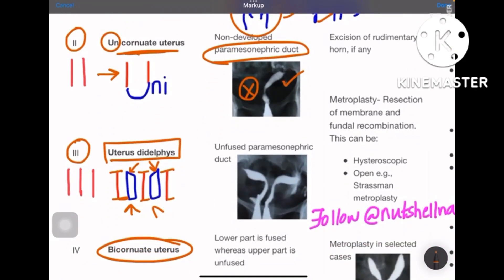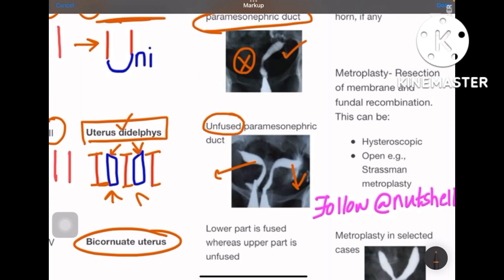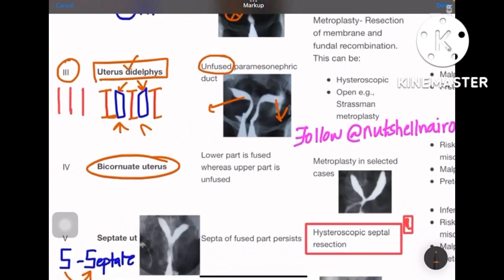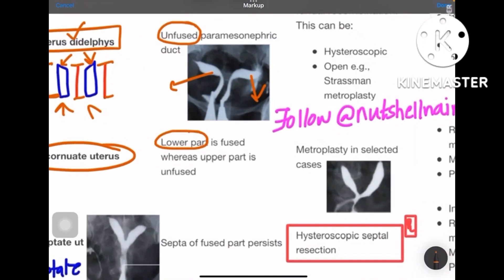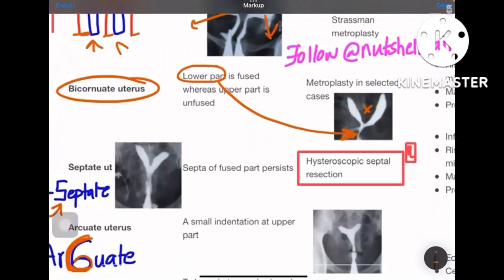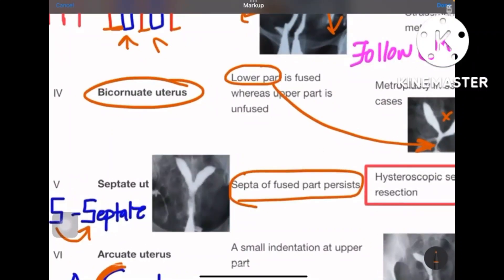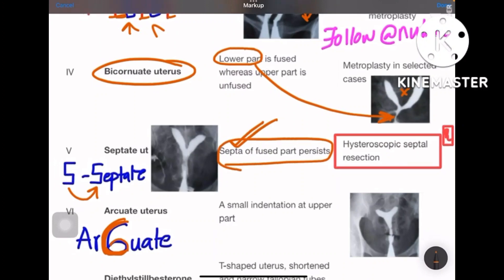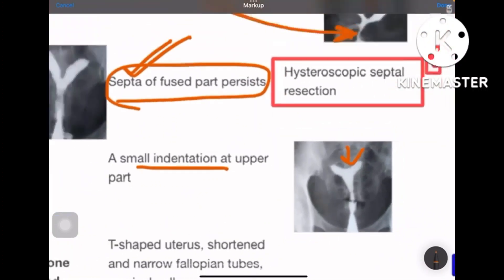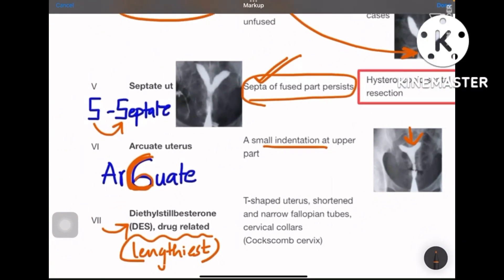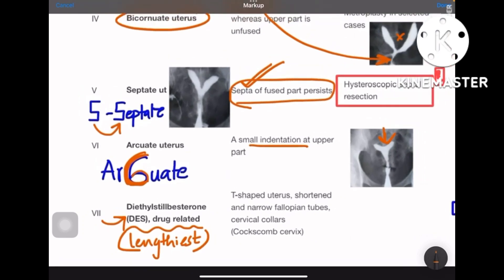Class 3, uterine didelphys, results from unfused Müllerian ducts, giving two separate compartments. Class 4, bicornuate uterus, has only the lower part fused while the upper part remains separate. Class 5, septate uterus, occurs when the septa of the fused part persists — normally the septa disappears, but here it remains. Class 6, arcuate uterus, has a small indentation in the upper part. Class 7, DES-related, produces a T-shaped uterus with shortened and narrowed fallopian tubes and a coxcomb cervix.